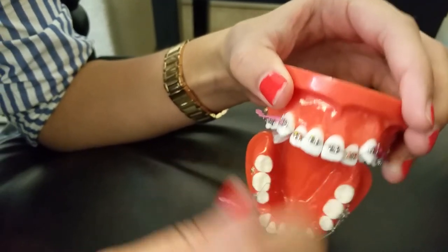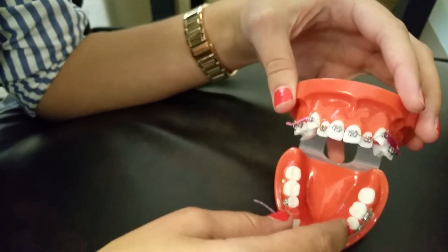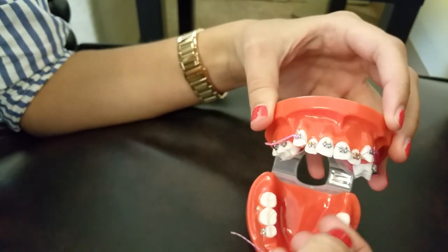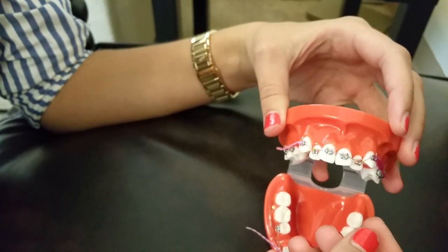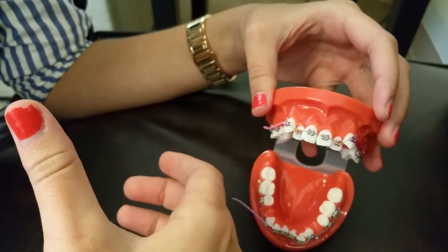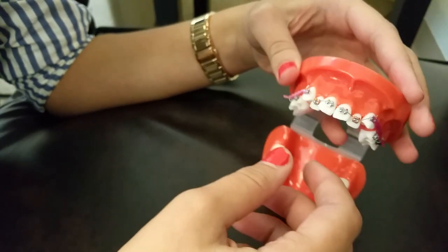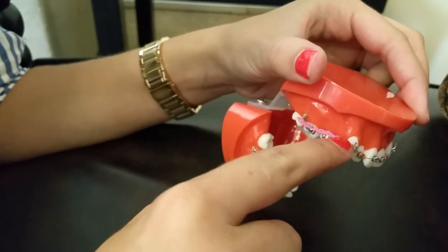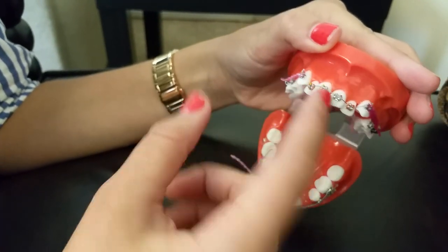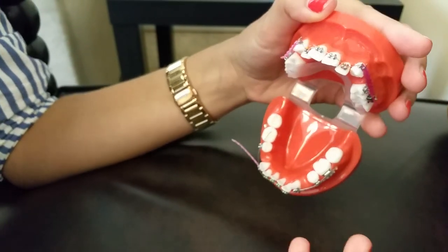Why would you use a stainless steel ligature tie versus plastic or elastic? The wire is stronger since it's not plastic, and we use it to keep the tooth where it is — just gliding along the wire instead of rotating side to side or up and down. Whenever we use power chains, we always want to put stainless steels to avoid teeth from rotating, unless we want them to rotate, in which case we wouldn't place a stainless steel.